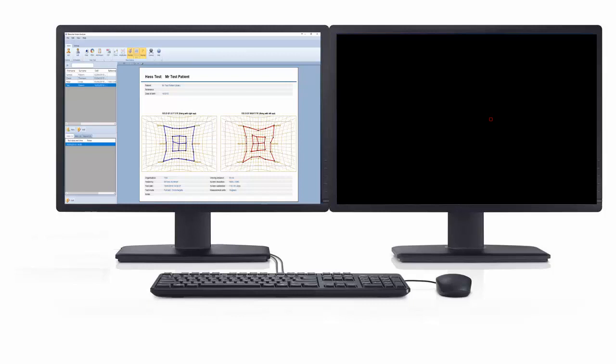The first version of the software was created in the late 1990s and subject to a clinical evaluation in conjunction with orthoptists and ophthalmologists at Moorfields. Versions of the software are used in hundreds of clinics worldwide. The software will run on any PC running Windows 7 or later.